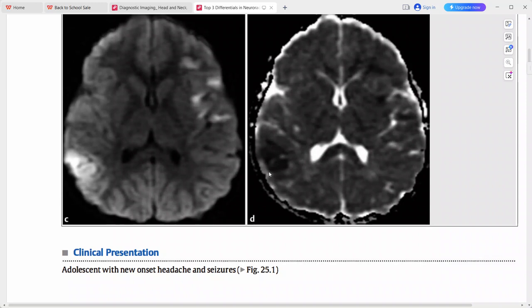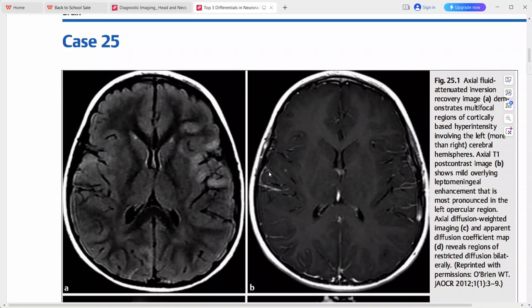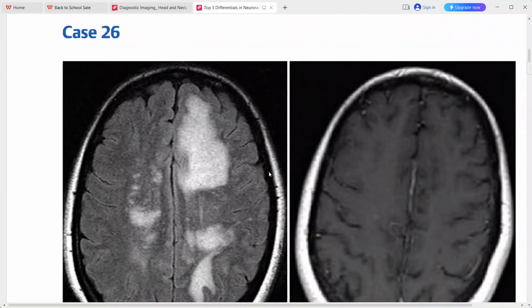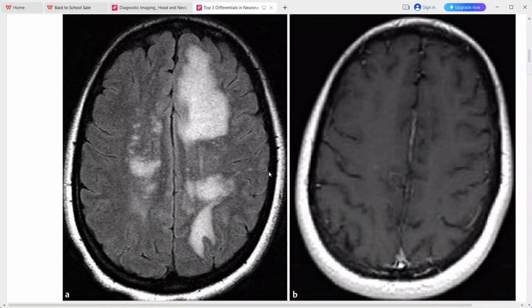The top differential will be cerebritis. However we can also include ischemia or infarcts, contusions if there is a trauma history, vasculitis, cortical tubers, and MELAS — that is mitochondrial encephalopathy with lactic acidosis and stroke-like episodes — in the list of differentials. This is a case of cerebritis.